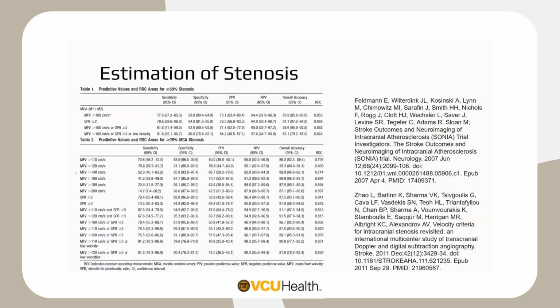So I think with these cutoffs, we can get decent performance, especially in terms of negative predictive value and ruling things out. For positive predictive value, no matter what cutoff you use, you're somewhere in the 40 to 60, 70% chance range. And there's always a trade-off, obviously, in terms of increasing specificity versus losing sensitivity for these criteria.